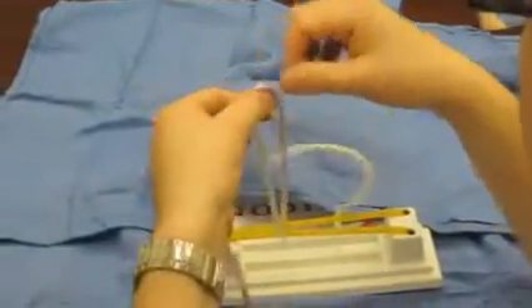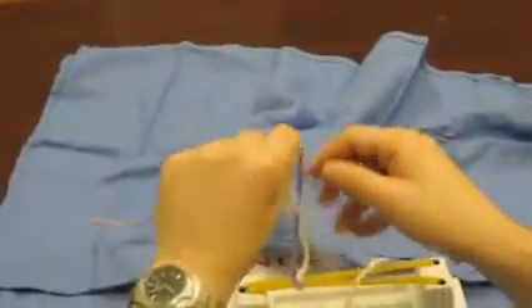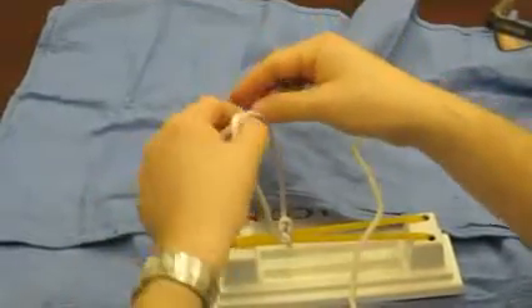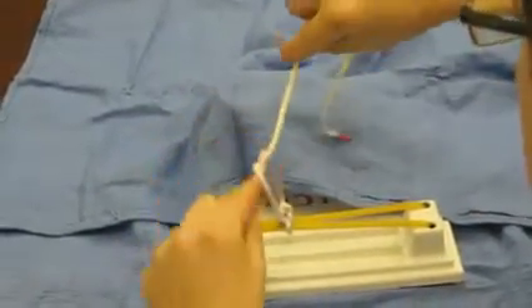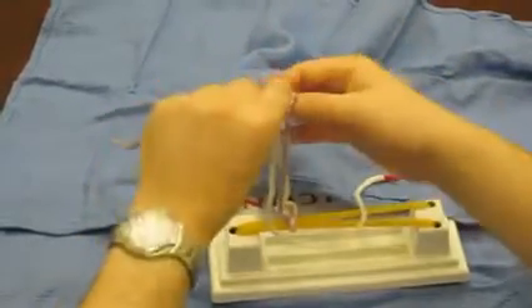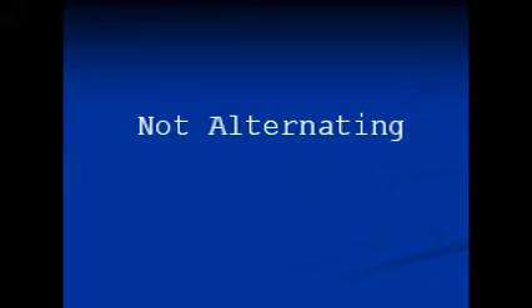If we're looking at this from a different angle, it's the same idea. The tail goes in one direction, and then on the opposite throw, the tail is to come to the opposite direction. From this angle it looks a little bit clearer in that the arms aren't crossing. The tail goes to the opposite end, but your right hand isn't crossing your left.